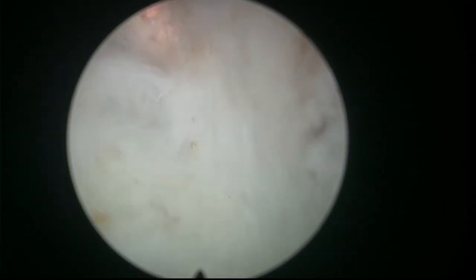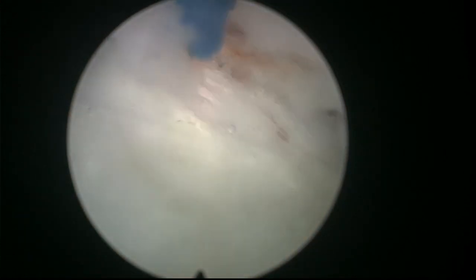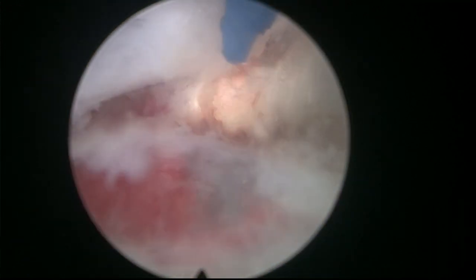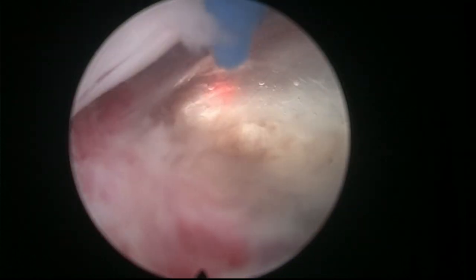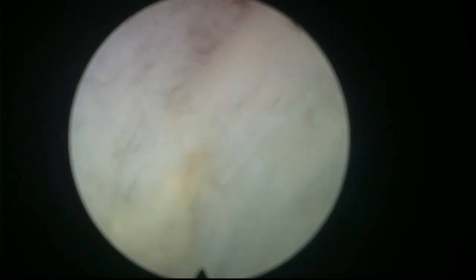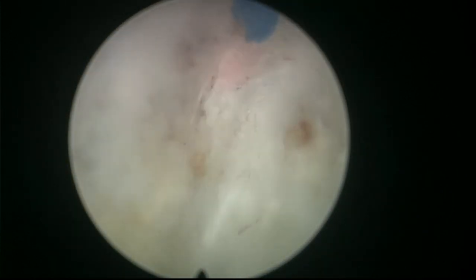So that's the origin of all this. Then we studied our experience with holmium en bloc. We compared this to GreenLEP, and we saw that we had even less incontinence with holmium en bloc, because of course when you do GreenLEP you have to do a mechanical dissection of the plane all around the capsule, and that probably means more traction, and I think that's probably the cause for a higher rate of postoperative stress incontinence with GreenLEP and a little bit longer lasting. So we decided to move to this en bloc early apical release holmium enucleation.